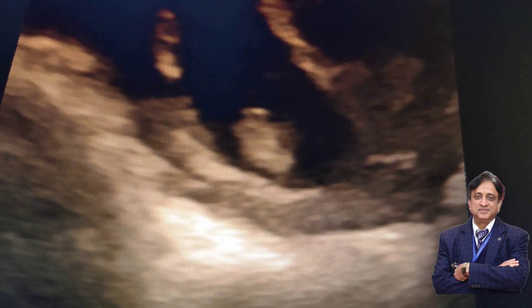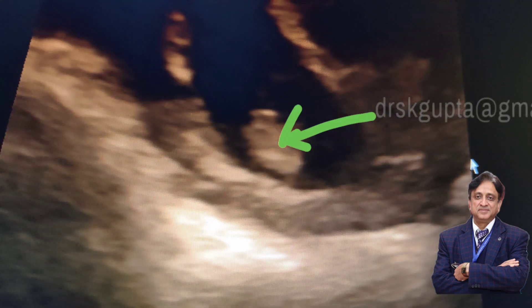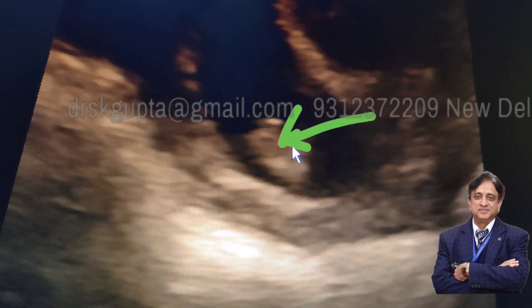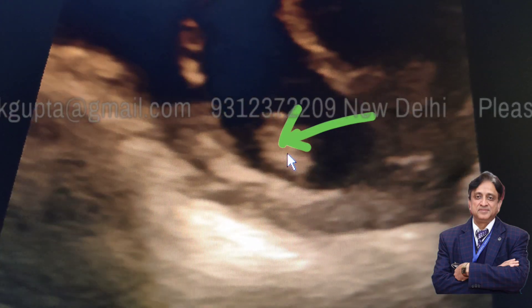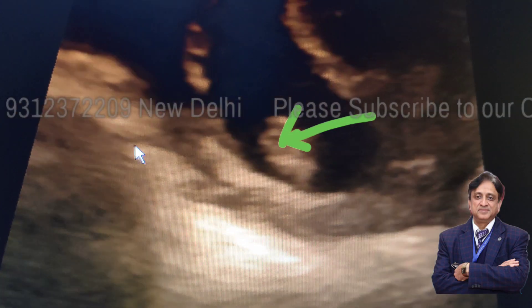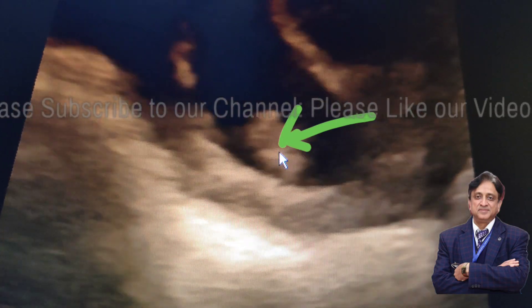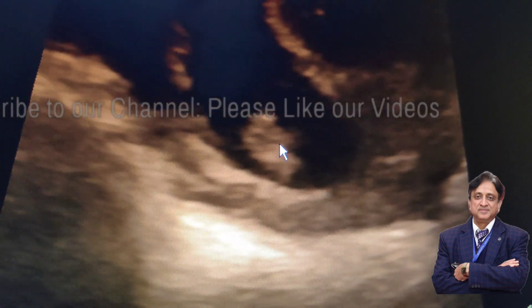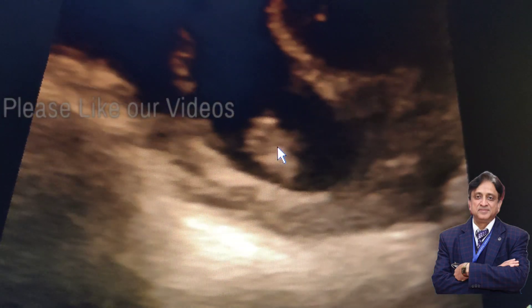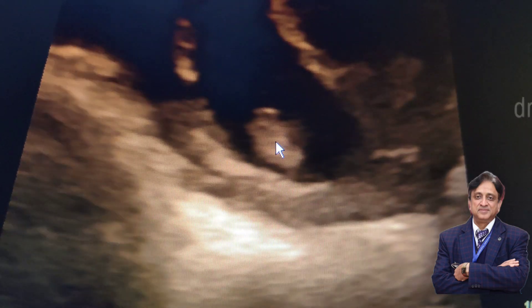After you have measured the crown-rump length, try to look for the cardiac activity. You can see that this is the beating heart. Sometimes it might be difficult because the entire image is shimmering. But this is the rhythmical fast beating heart inside the fetal pole — this is the cardiac activity.